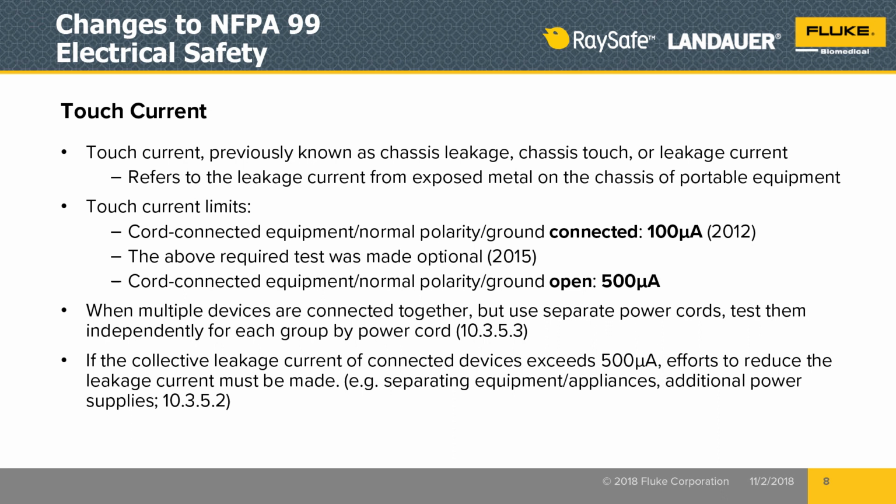We also wanted to highlight here, I know this is a pretty dense slide with a lot of information, that in the cases where you have multiple devices all plugged in together, whether they're treated as part of a system or it's just a rack of equipment in an operating room or something else, if you do exceed the limit for the leakage current when you're testing things as a system, it is okay to break apart the system. What's important is wherever the plug is going into mains, however many things that it's connected to downstream, all those things that are connected to the one plug are all tested together as a system for the total leakage current, making sure that everything is still safe with everything plugged together.